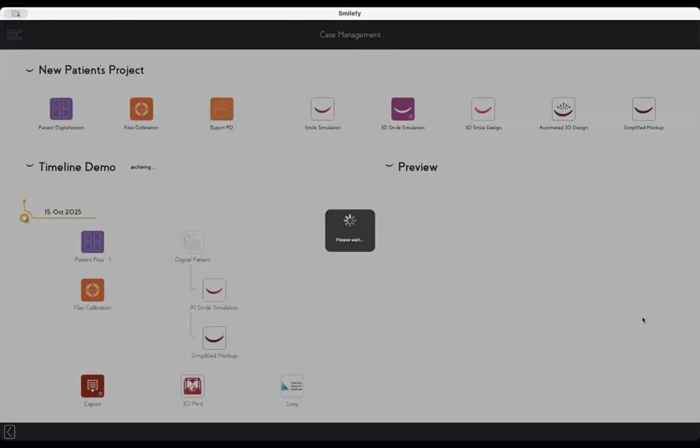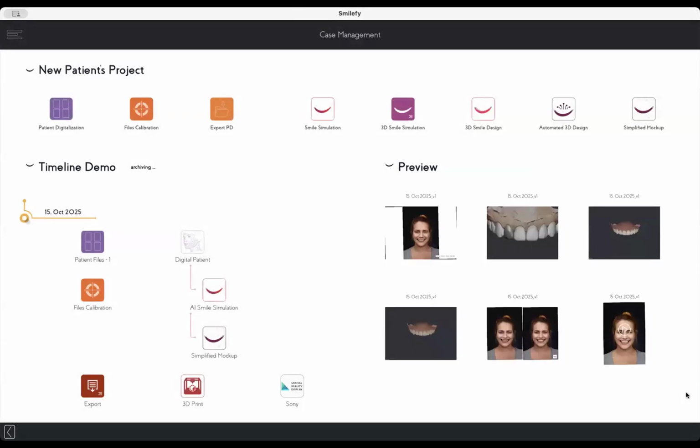So, you know, it is a learning curve, but we never start with the most complicated case. I'm going to show you at the end, we do have a very structured course.